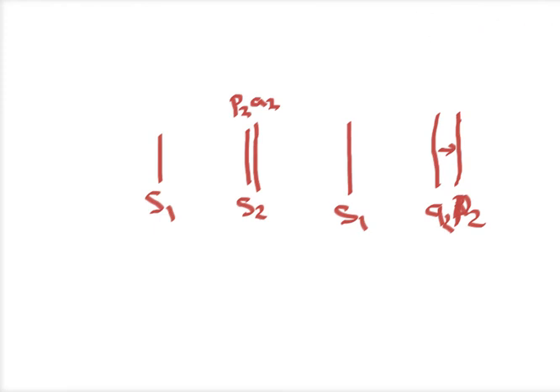So if we look at this, this is expiration. I'm sorry. Let's clear that. This is inspiration. And this is expiration.